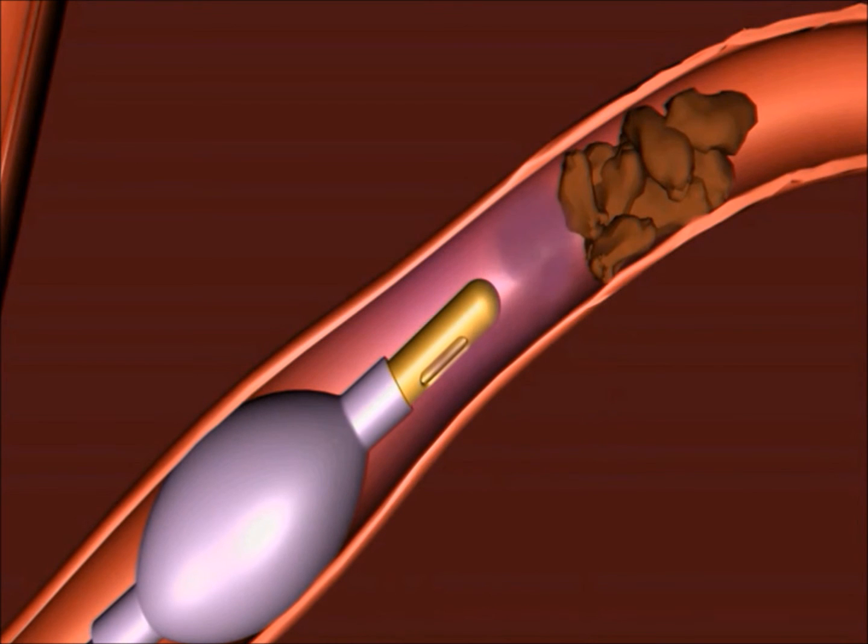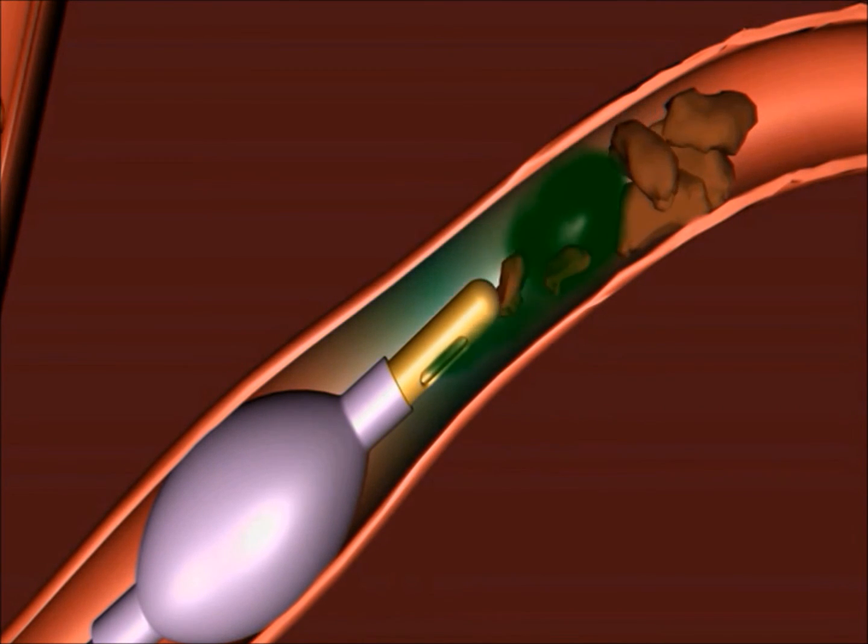A series of saline flushes with contrast dye are performed until the physician is confident that the sealed ischemic site has no more blood. This is followed by infusion of drug which is done simultaneously with aspiration using the guide wire lumen, creating a vacuum-like fluid flow.